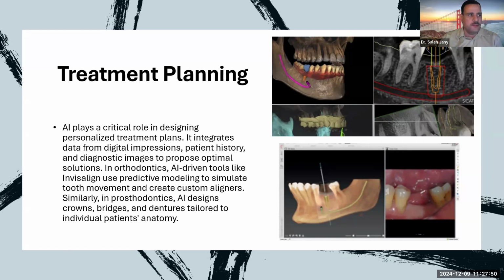We have the sinuses, we have the nerves, we have the buccal plate, how much bone we have, the thickness of bone. The regular dentists see the X-ray and think, we can use this size of implant.